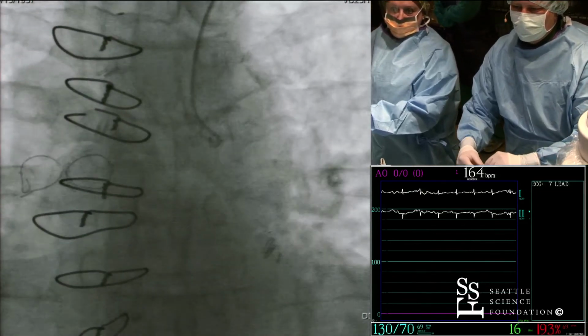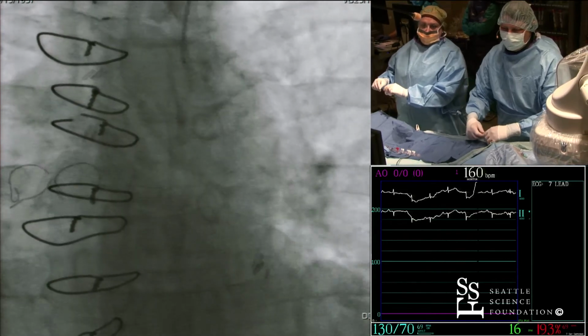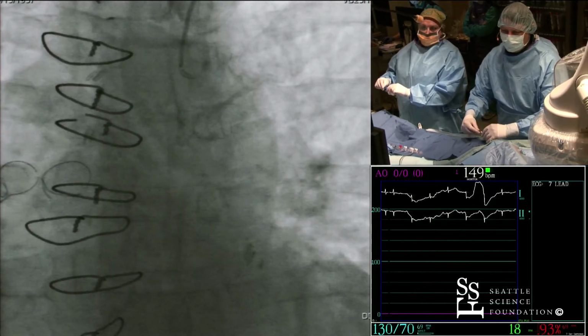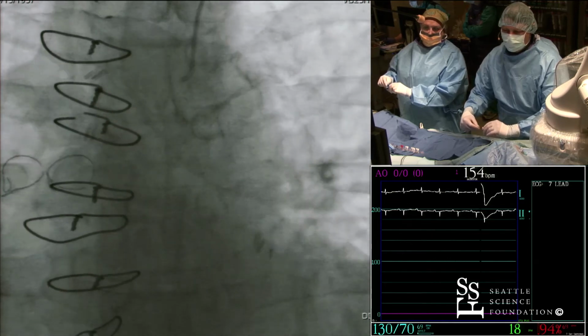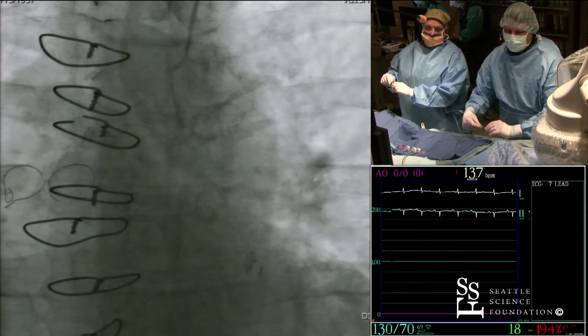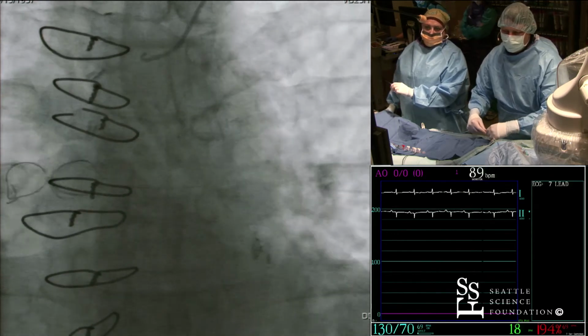So we'll typically go in with a R4 or R3.5. And then John's going to be able to crank that clockwise and move the tip over there, and now the tip's almost there. There we go. Almost. And he's going to be able to go down. We need to pull back just a little bit. And there we go.